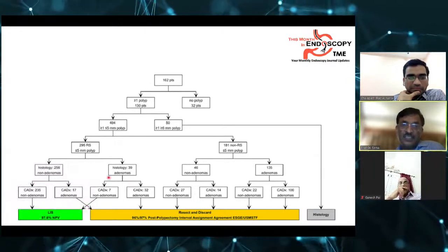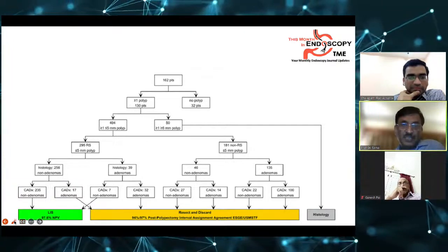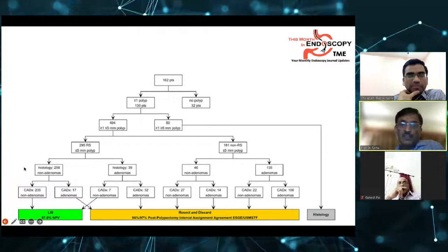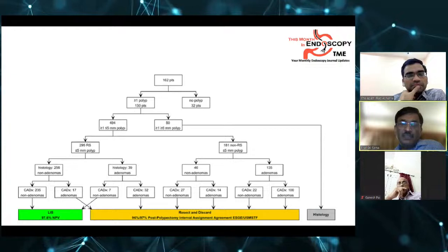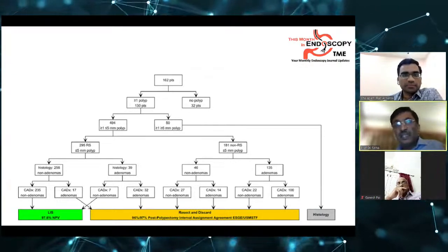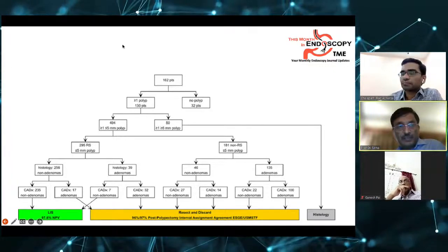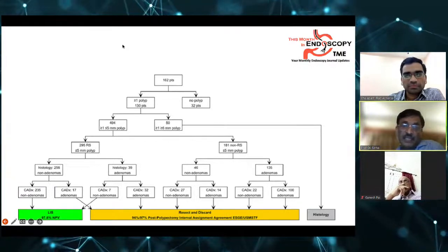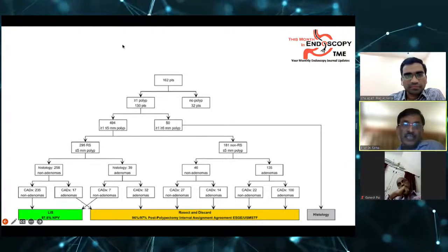Second, I have some first-hand experience of being involved in the development of such a program. I was working with Endovision Hong Kong, which is a startup from Indian IIT guys, and we were developing the program. Some of you have seen Dr. Goenka show part of that program, a very small part, in one of the endoscopy meetings. What happens is that you need a very clean area for detailed evaluation.